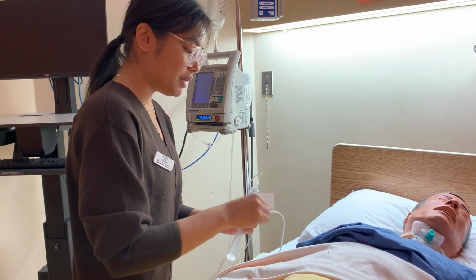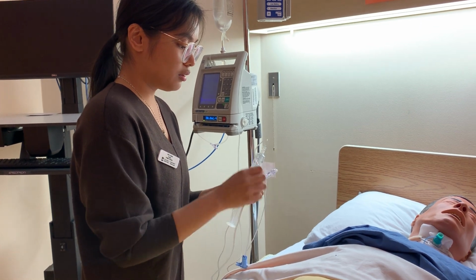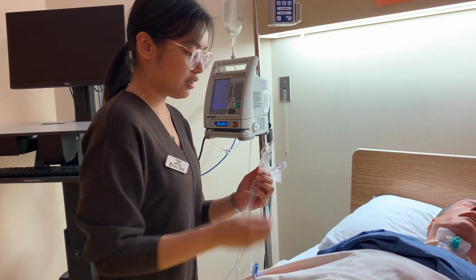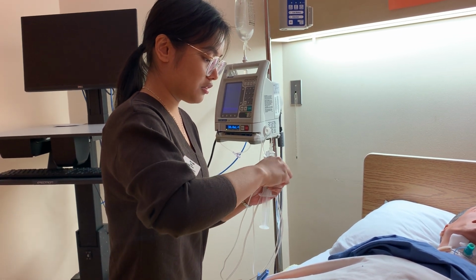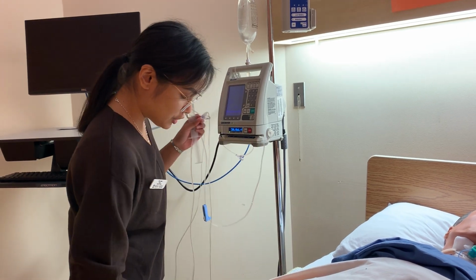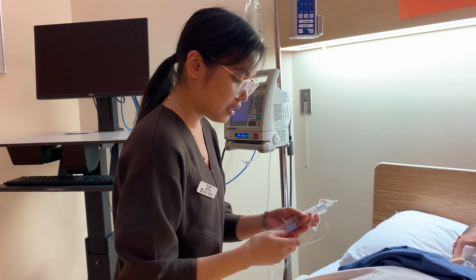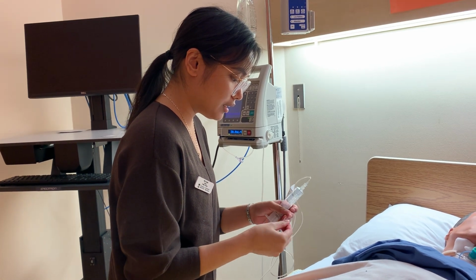I'm also using this port because the patient is not using an IV push medication. Maintaining sterility. Okay. And I'm just going to cap it to make sure I'm not accidentally plunging or infusing the patient.